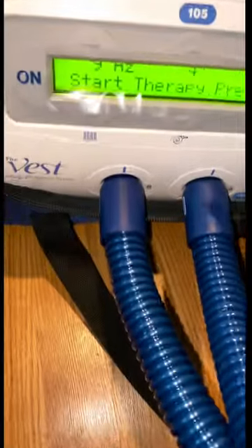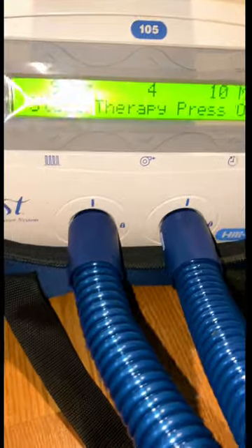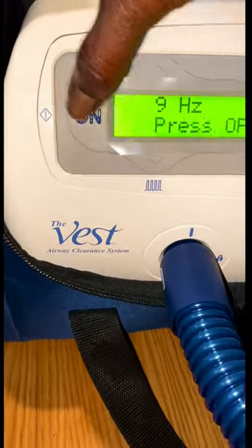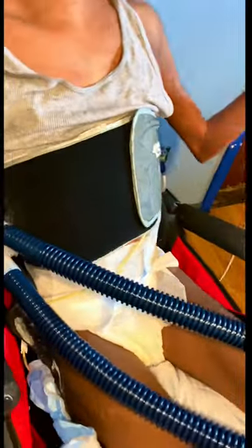Once we have that inflated and we know it's ready to go, we go back down to it and hit the on button. It's set for 10 minutes at 9 hertz, so we let it rock and roll.